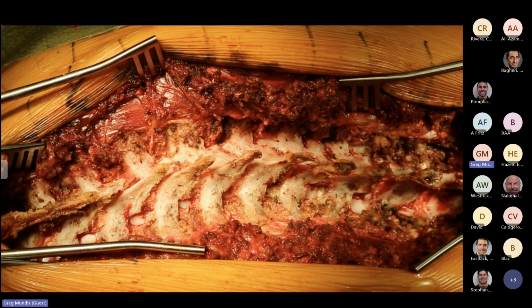A couple things on the technical nuance, because a lot of times you're passing this bone off, but you have to realize that the bone you just passed off, the undersurface of it, is also articular cartilage.